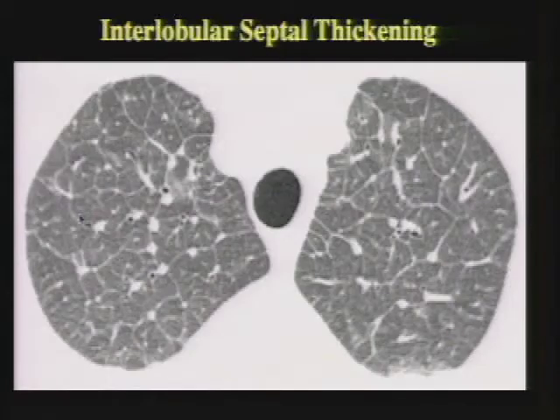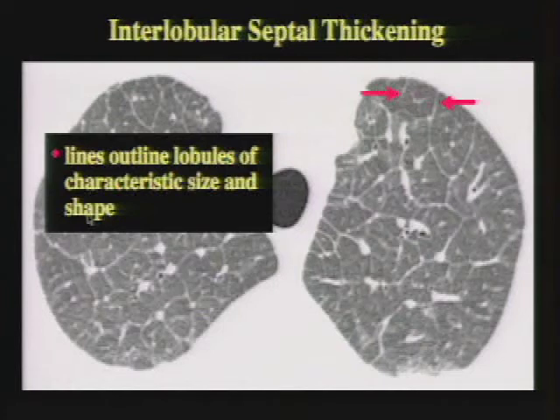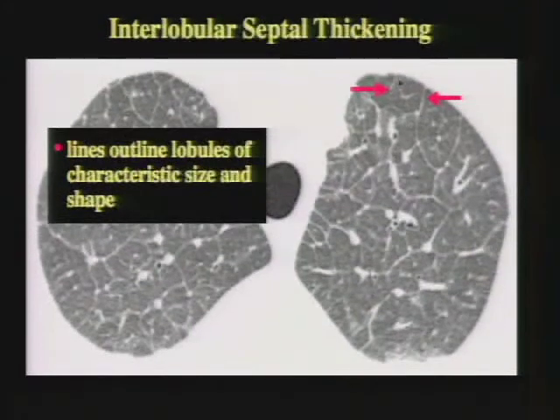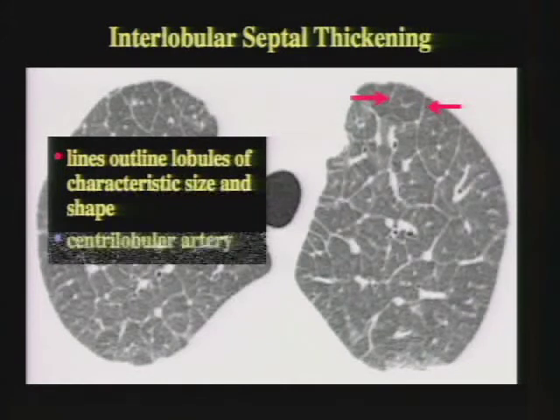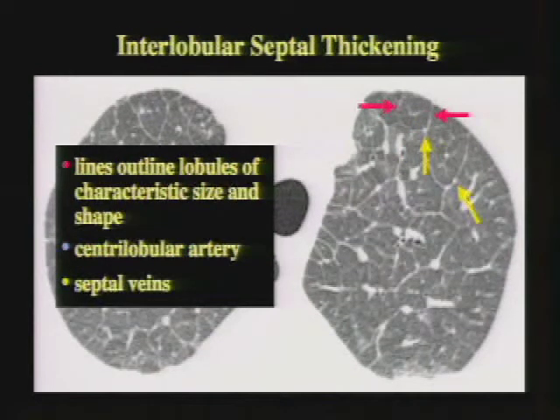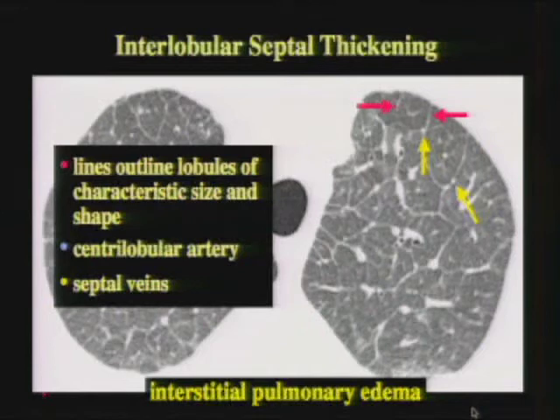The first abnormal finding you should look for is interlobular septal thickening. It results in a reticular abnormality, and you can tell the lines represent thickened interlobular septa because they outline secondary pulmonary lobules based on their characteristic size and shape. Here is a very nice secondary pulmonary lobule in the lung periphery, marginated by interlobular septa, about two centimeters in diameter, with the central lobular artery visible in its center. This happens to be a patient with interstitial pulmonary edema, a common cause of interlobular septal thickening.